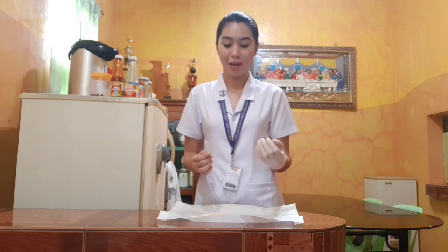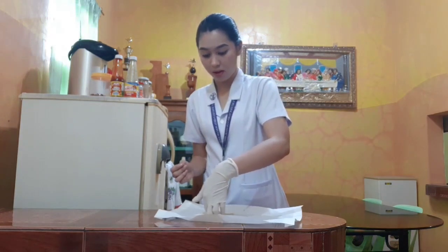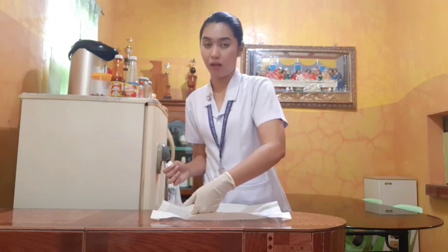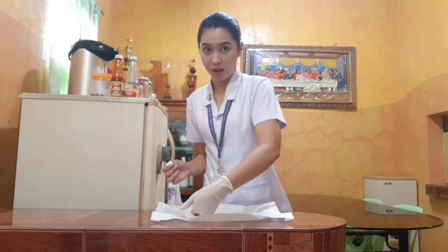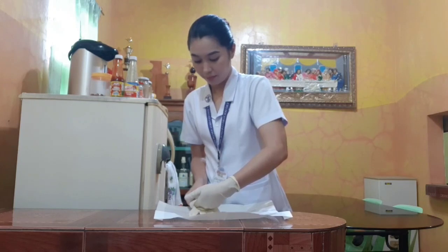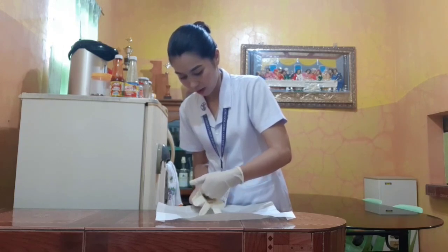Okay, now that we have gloved my dominant hand, next we're going to glove the non-dominant hand. So we're going to slip or insert the gloved fingers into the cuff of the second glove. We're doing this to avoid touching the exposed part of the second glove, because that exposed part is not sterile. Okay, now I'm going to insert my hand.